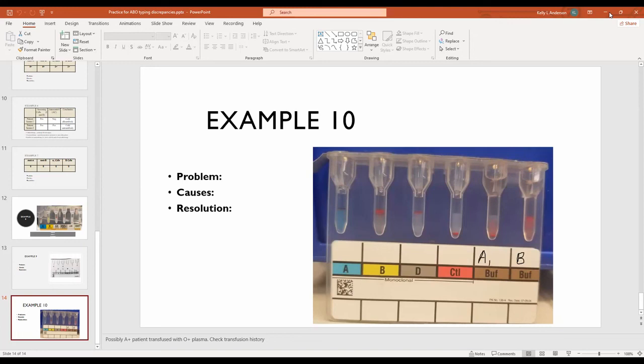It's extra proteins that are causing Rouleaux, which is basically sticky proteins making the RBC stick together. It's a problem because it makes you think there's agglutination when there really isn't. It's just stickiness. So you're adding your patient plasma, and this is the Rouleaux stickiness.